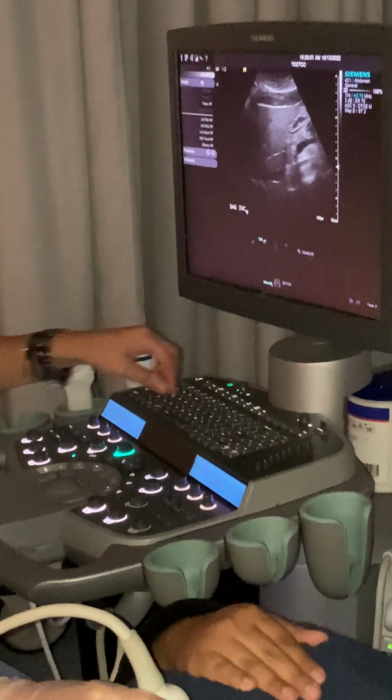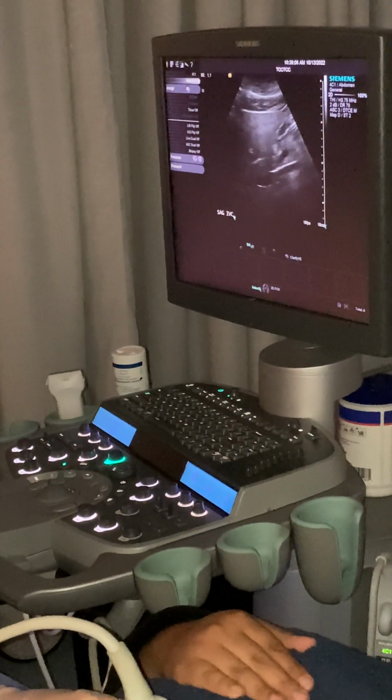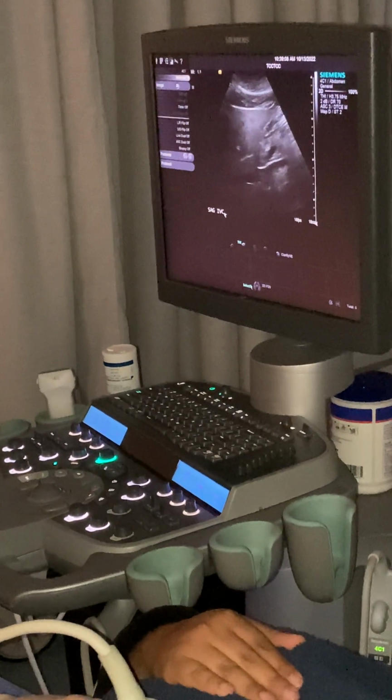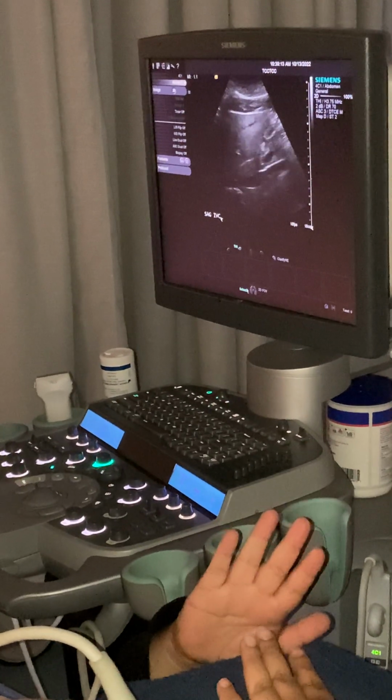Okay, so focus down, at or below, right? Why do we do that? Better image quality. Yes. And why is it better image quality? Because of the hourglass shape of the beam.